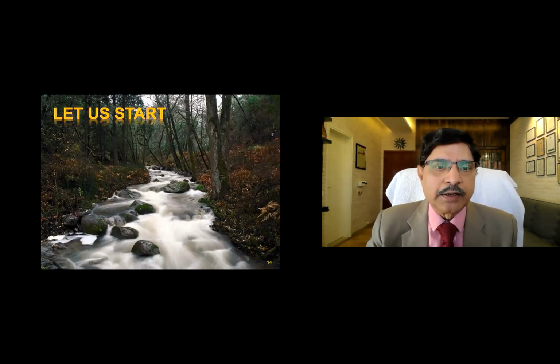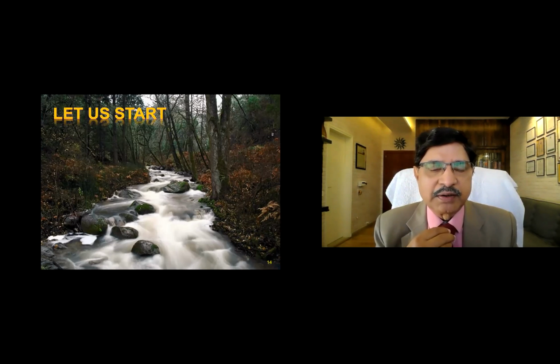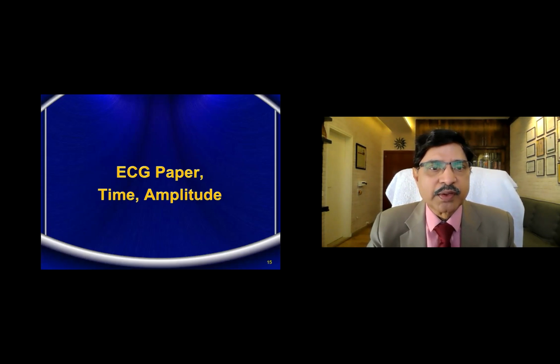So let us start. It is going to be a flow of a beautiful river there, nothing like nature, and just imbibe the content that is presented to us by great masters, and remembering that I am only a vehicle through which it is flowing, and I am not the author of any one of these things. So the ECG paper, time and amplitude.